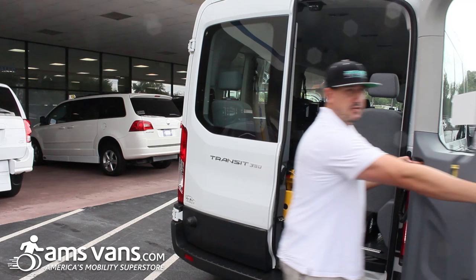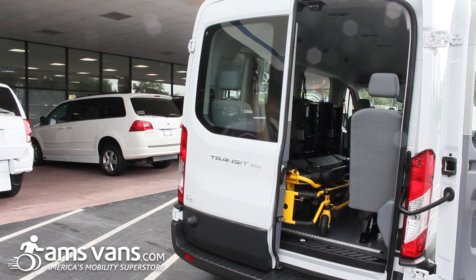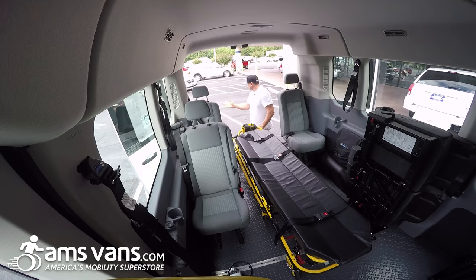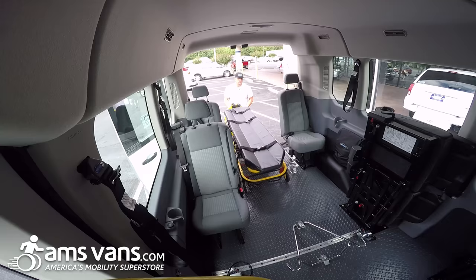The Ford Transit doors actually open all the way — it has a little magnet, same for this side as well. We have the Stryker MX Pro gurney here. It usually takes two people to pull this gurney out.